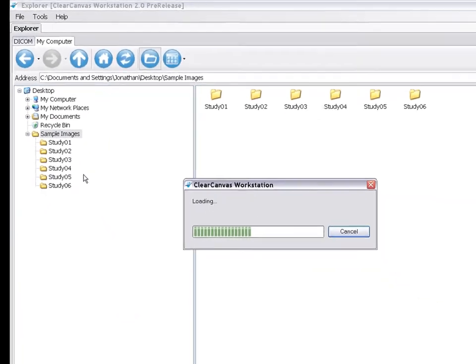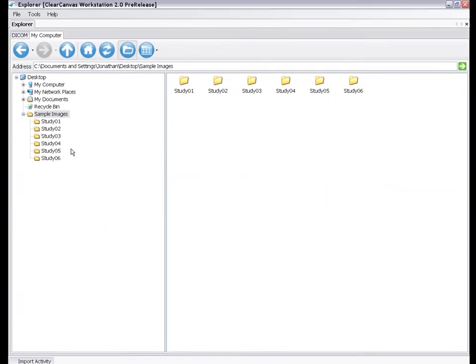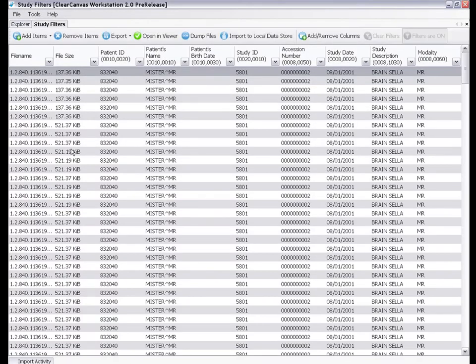All the images from your folder are loaded into the Study Filters tab, with customizable columns across the top that can be sorted and filtered.